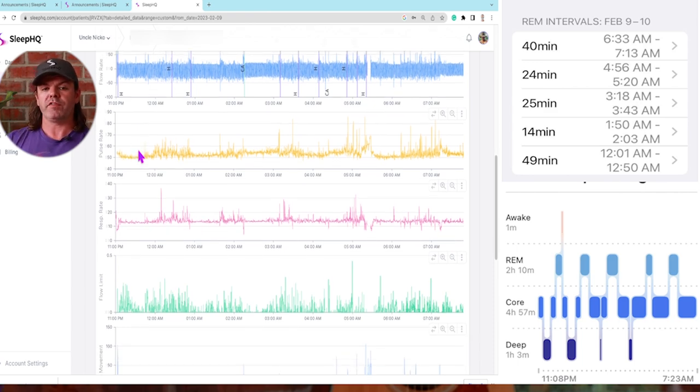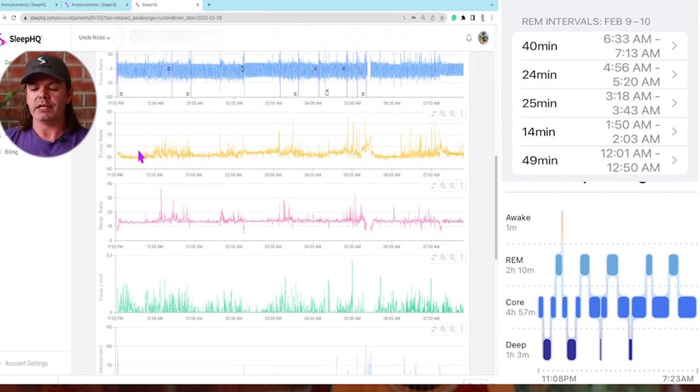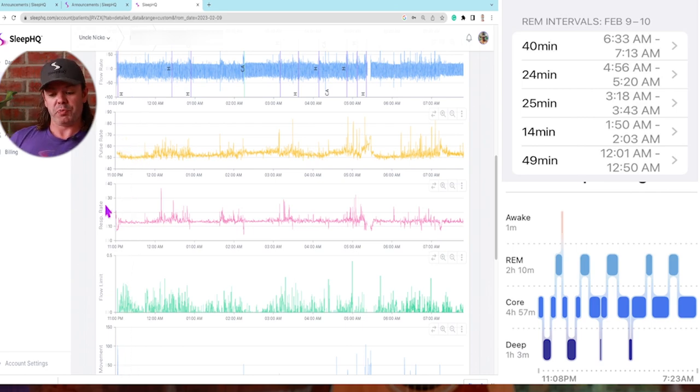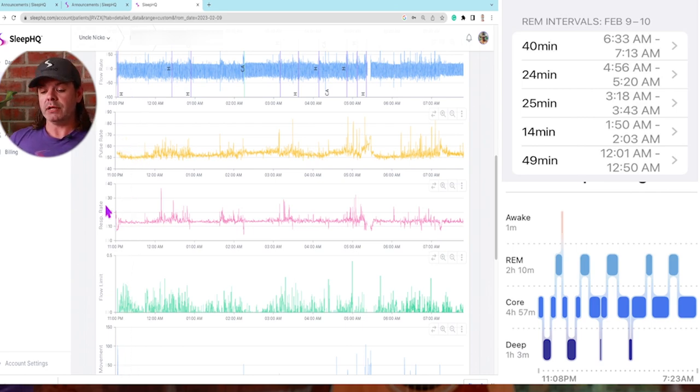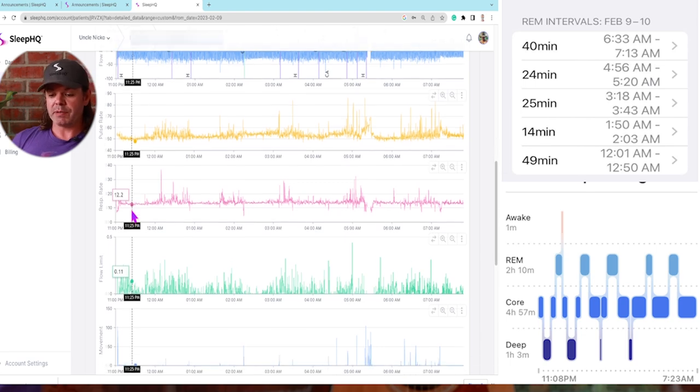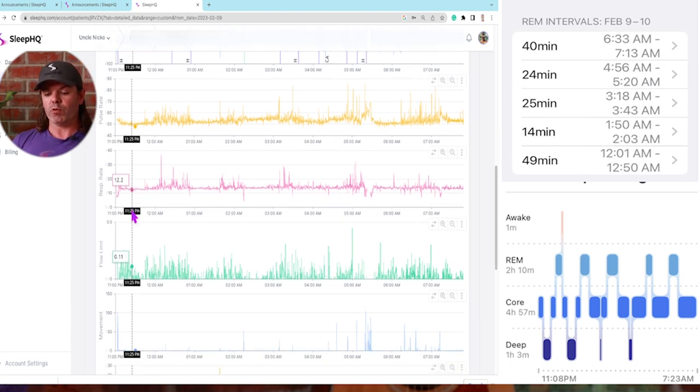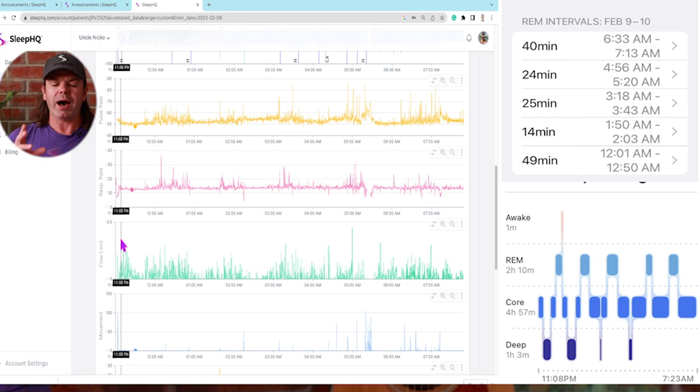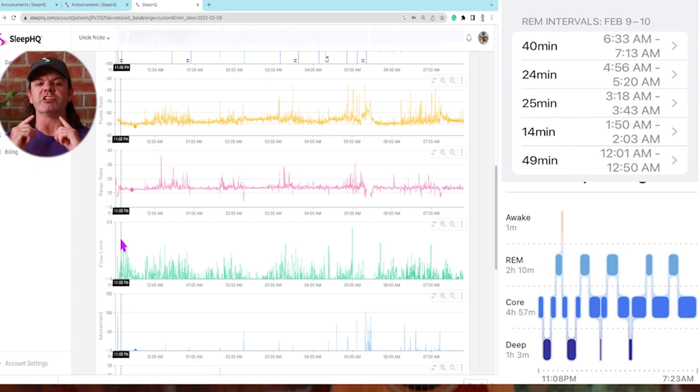We've got the pulse rate here. Now the pulse rate information is coming through from the O2 ring that he wears. Respiratory rate, breaths per minute. And then coming through from the CPAP machine. And we've also got the flow limitation here, partial upper airway restriction.